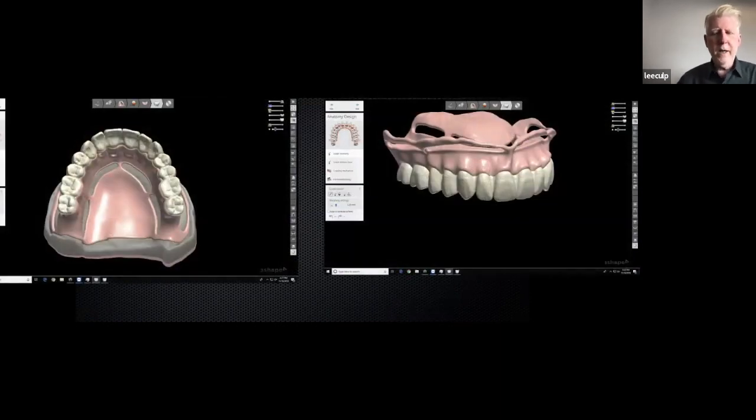So if we've made a denture and the patient's got the denture, then all of our planning is going to be from that original denture. Now, this is where it gets fun because I'm not going to start over. So now I'm ready to do the guide for John. I'm ready to do the immediate load temporary for John. And he'll know that day, since we've already made a denture, whether he can immediate load. If he can't, then he puts the denture back in.